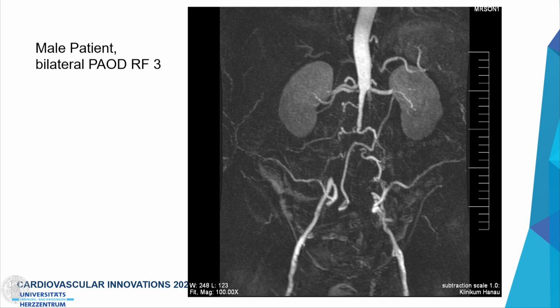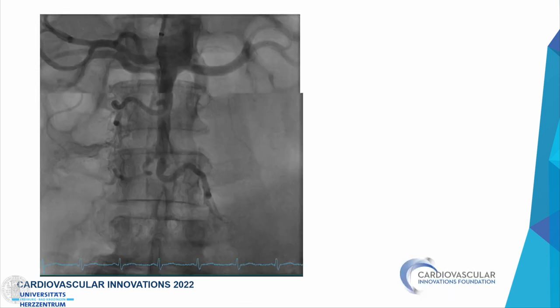The case I'm presenting shows MR angiography with an infrarenal aortic occlusion involving both common iliac arteries. There is nice lumbar artery collateralization to the bilateral iliac bifurcation with retrograde flow from the internal iliac arteries going into the external and down to the leg arteries. Of note, there is already some tapering of the aortic lumen just below the renal artery origins.